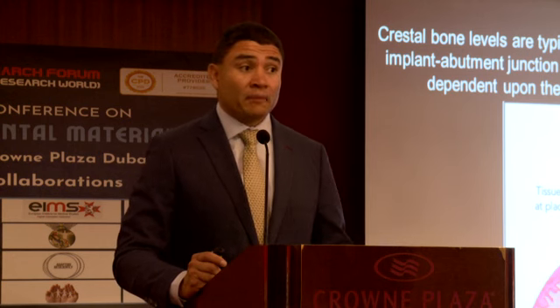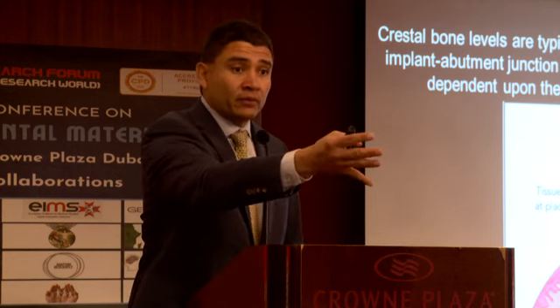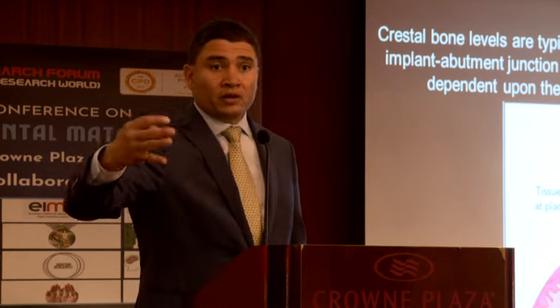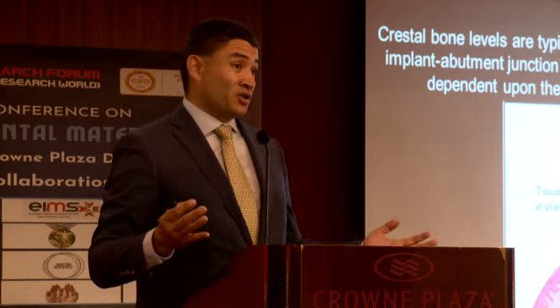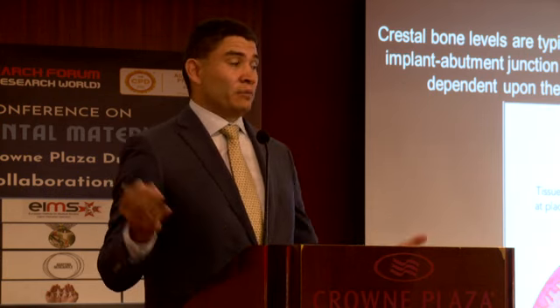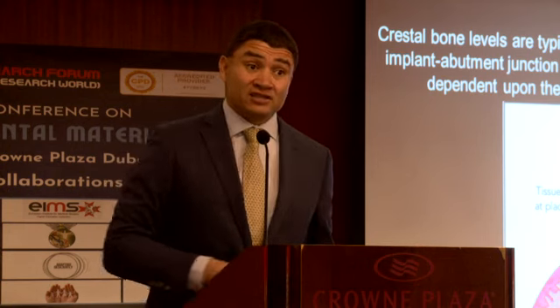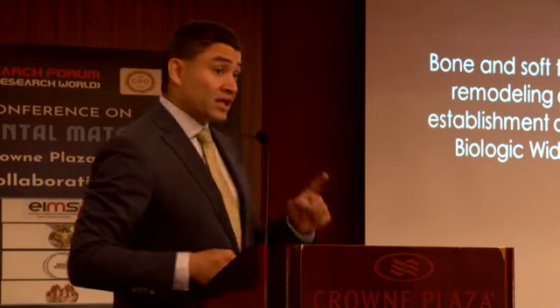And guess what's going to happen to the roughened surface? You're going to have biofilm that is readily attached to the surface, which will make it susceptible to start a peri-implant disease, right? So now start thinking about, should I place that implant that everybody talks about, that is roughened surface all the way to the top? Oh, well, can we cheat the system? Yeah, we can cheat the system. I'll tell you how to cheat the system in a moment. So that is one thing.